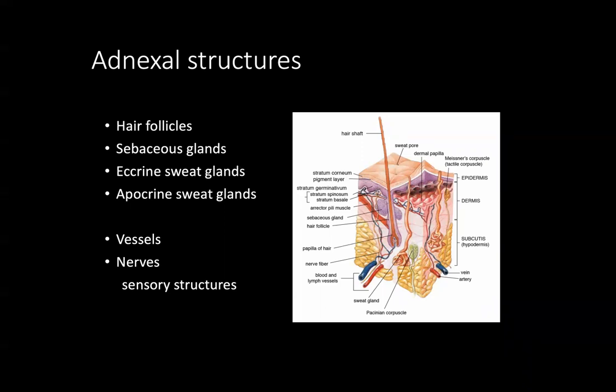Sebaceous glands are one of my favorites in the skin. They're responsible for producing oil, so it keeps our skin protected and hydrated. But when overproduced, they can also cause follicular plugging and development of lesions such as acne and oily skin. It can be a source of cosmetic concern as well, as patients don't necessarily like to have oily skin.